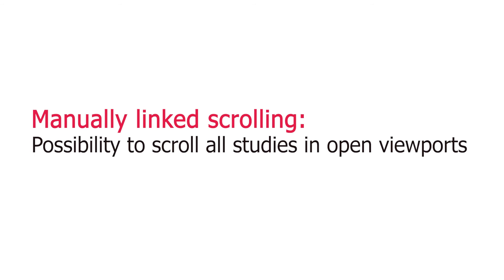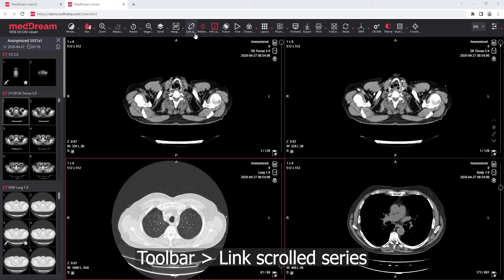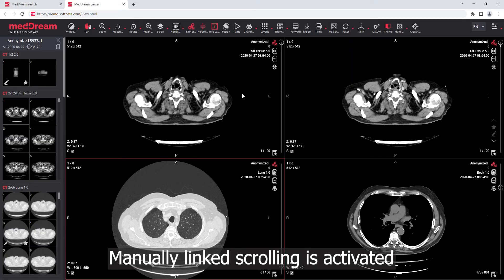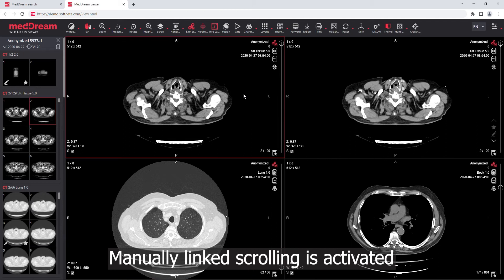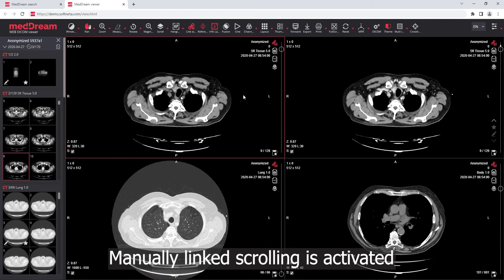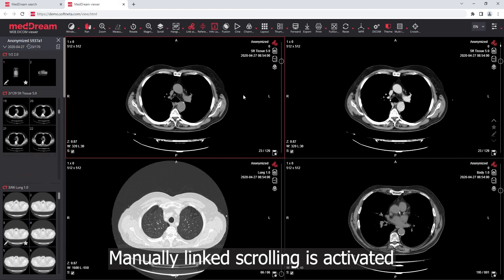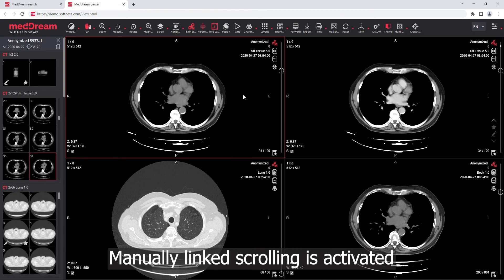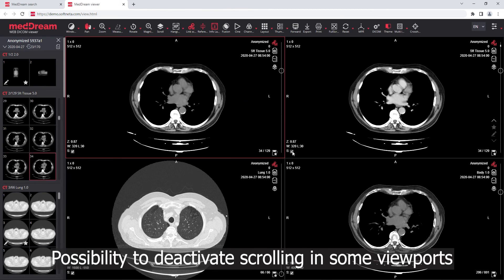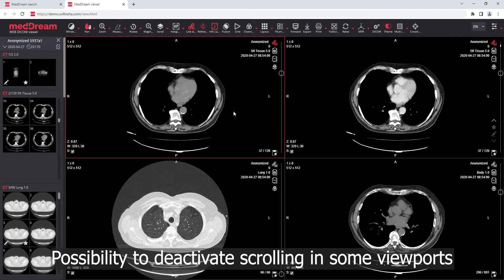Manually linked scrolling: possibility to scroll all studies in open viewports. Press the Link Scrolled Series button on the toolbar. Manually linked scrolling is activated. There is also a possibility to deactivate scrolling in some viewports.